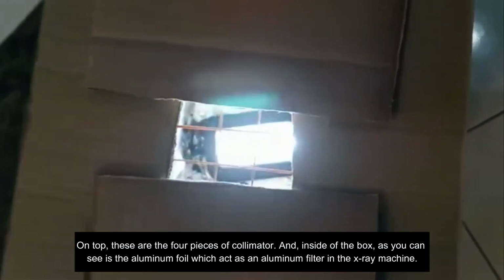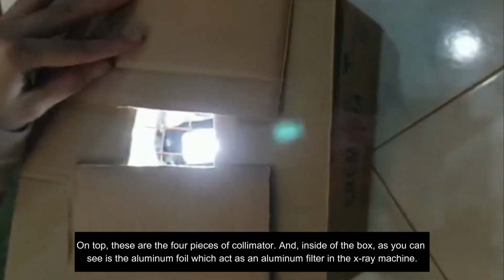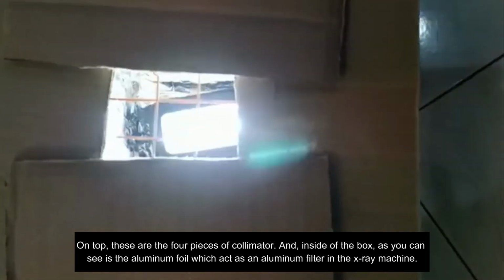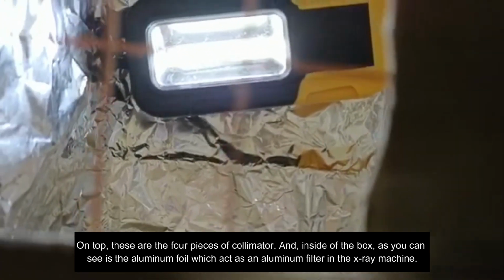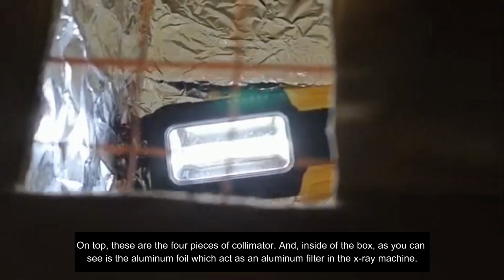On top, these are the 4 pieces of collimator. And inside of the box, as you can see, is the aluminium foil, which acts as an aluminium filter in the X-ray machine.